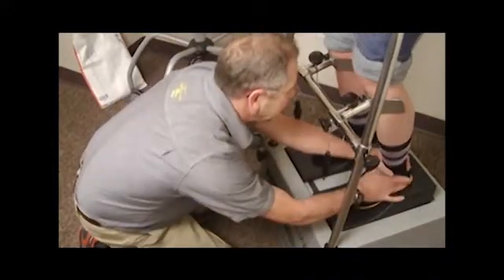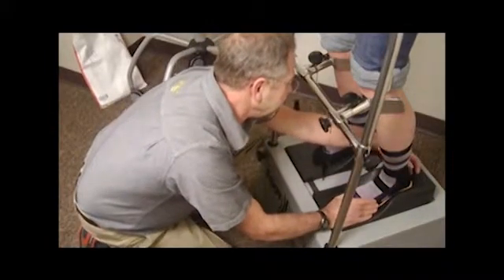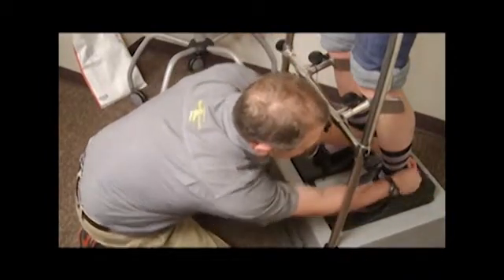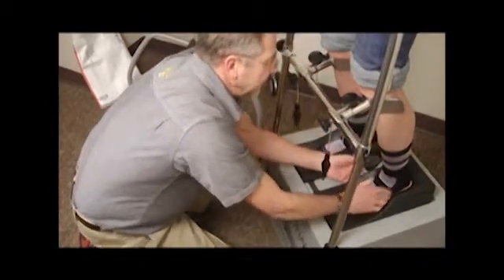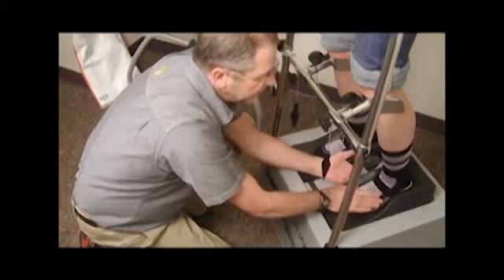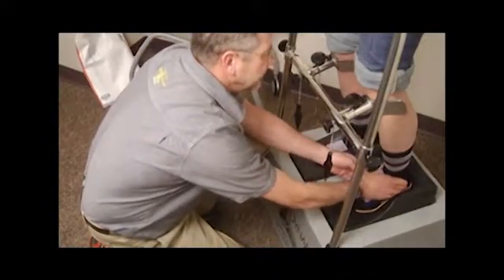And go ahead and step down for me and bring both knees forward into the knee cups. Now we have the patient back in the position that we had initially. And I'm going to take the time, since we've got about a minute for this to cool, to make sure that it's nice and tight around the heel, up into the arch, slightly elevated. The soft tissue can be compressed in the arch so that it's nice and accurate to the foot. So now as the impression core is cooled, you can lift your foot up.